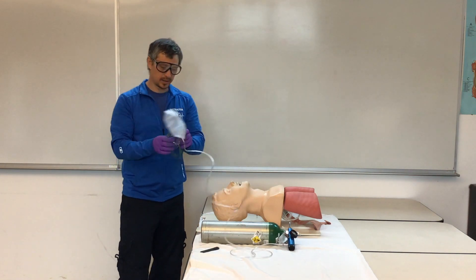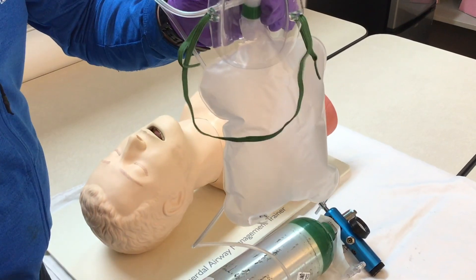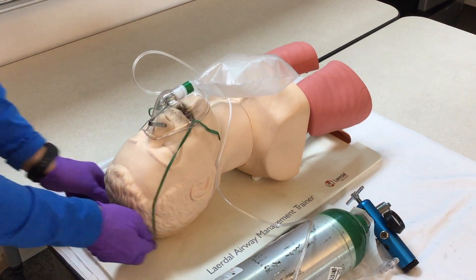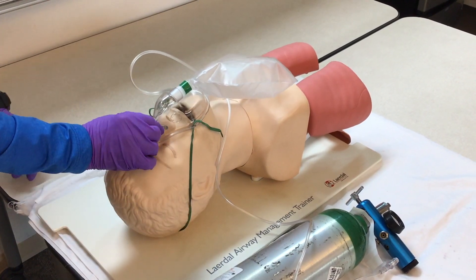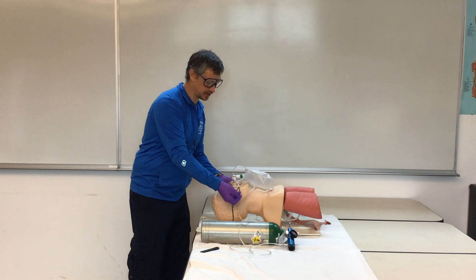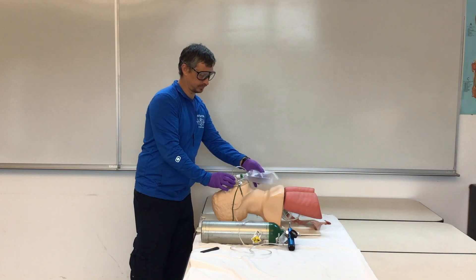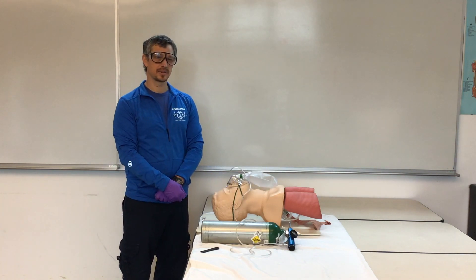Then, talking to our patient, we'll put this mask over their face. This is going to go over your face and around your head, and then we'll pull these green tabs to secure it to our patient's face and squeeze this over their nose. And that's our oxygen administration.